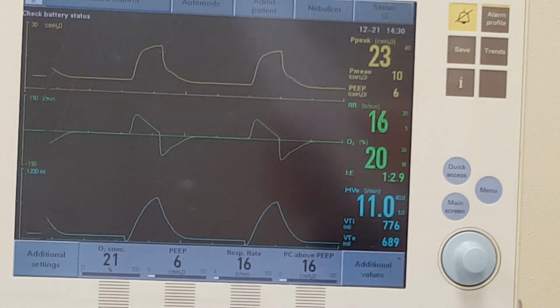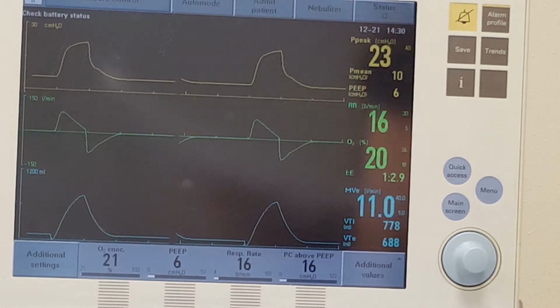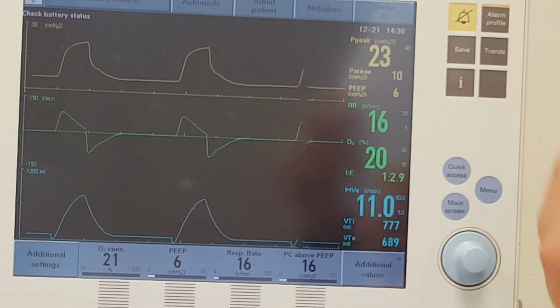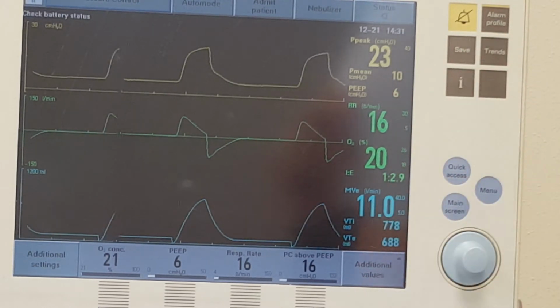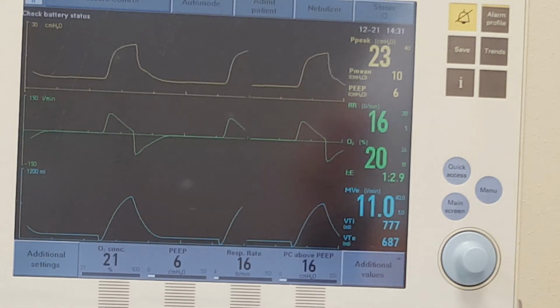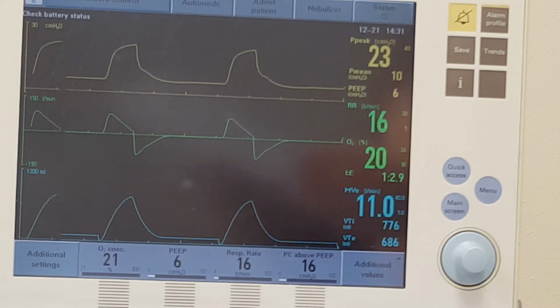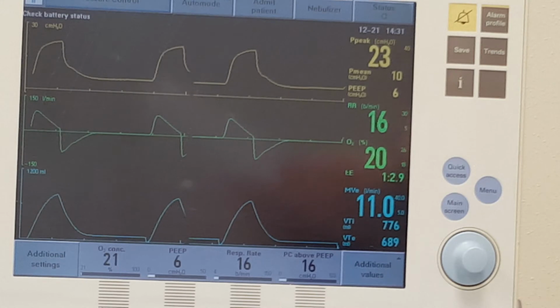So you will note that was the initial setup. It says do a check, so we're going to chart all of our numbers. Remember, we're in pressure ventilation, so we expect pressure to stay fairly constant. Where we expect our changes, they're in volume, minute ventilation, and inhaled and exhaled tidal volume. Well, notice the next request is to decrease compliance to 20.